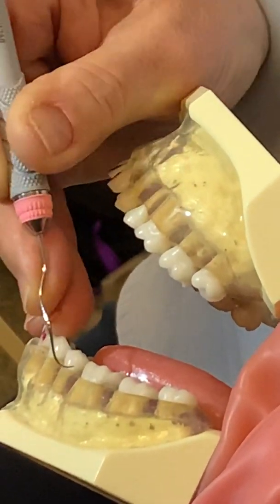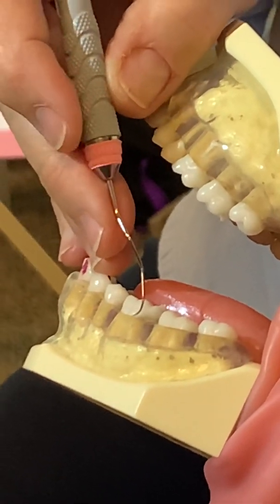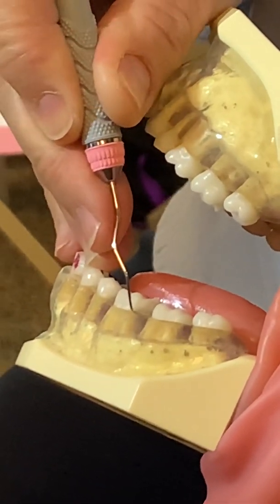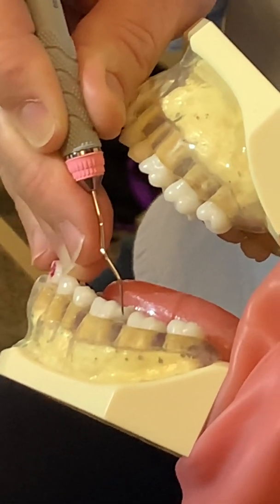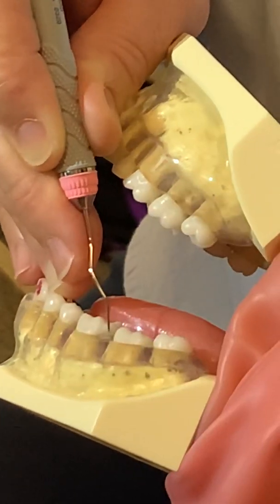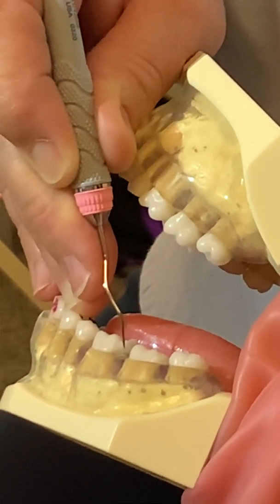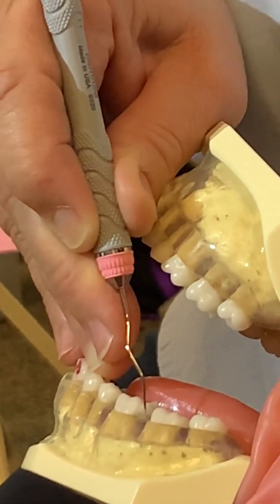And then the stroke would look like this. So check it, get your grasp really nice here, right there. Roll it in, tapping. Don't go deeper than the CEJ with this instrument ever, because you'll get into trouble. Make sure when you're at the distal or at the proximal that your terminal shank is against the contact, and then go up and down at least 5 times. We have to know that your tip has to reach the col, which is the middle of the proximal at the CEJ, right? Up and down.